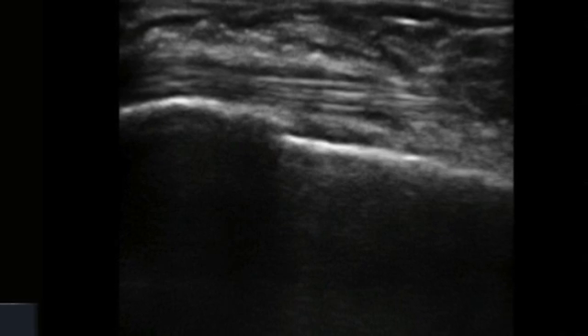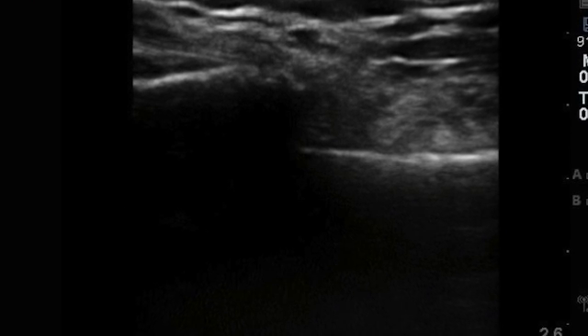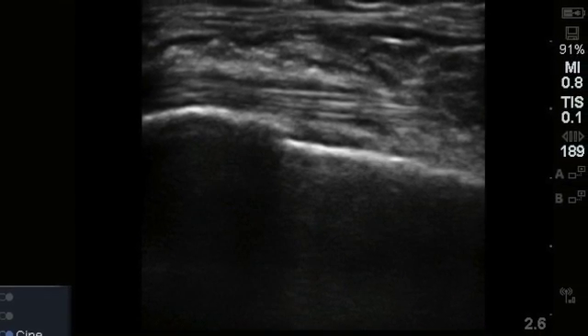Before and after images are shown demonstrating the improvement in alignment. Be sure to wipe all of the ultrasound gel away before splinting.